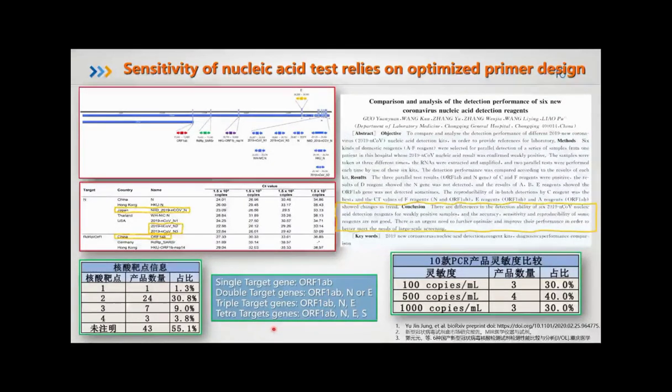Secondly, among 10 mainstream double target gene detection kits, they have different sensitivity according to their instruction sheets. The higher sensitive ones, such as the ones that could detect as low as 100 copies per mL viral RNA, could have an advantage on weakly positive sample detection.